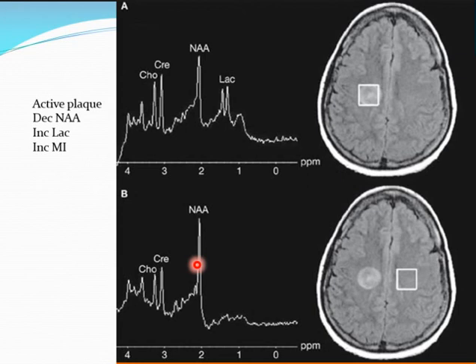We said previously, everything causes decreased NAA, so you cannot use it to diagnose. It just helps you, guides you, directs you to certain diagnoses rather than others. You need clinical data, you need MR images, you need CT images, you need everything. It's just an accessory, the MR spectroscopy. You cannot depend on it to diagnose anything. Okay? Keep that in mind. Everything causes decrease in NAA peak.